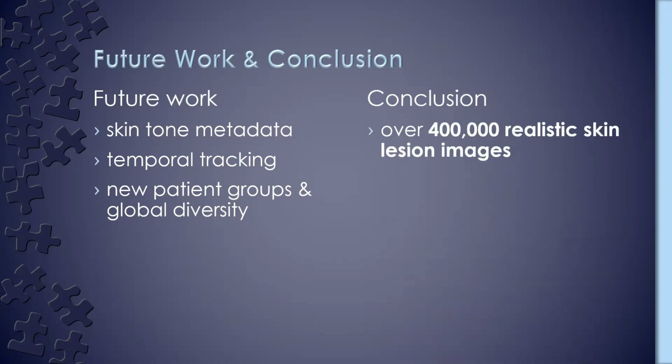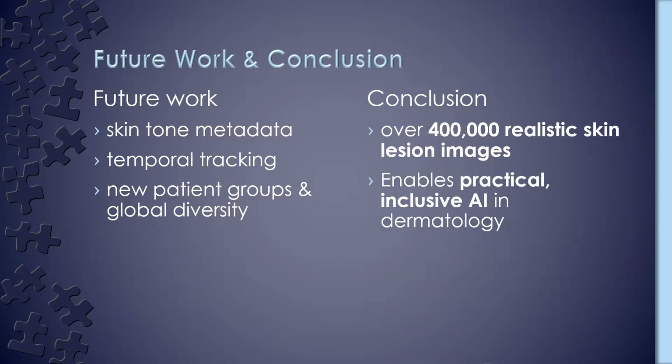Conclusion. First, it contains over 400K realistic skin lesion images. Secondly, it enables practical, inclusive AI dermatology because anyone can use it with a smartphone. And lastly, it is freely available, which is important for future development.